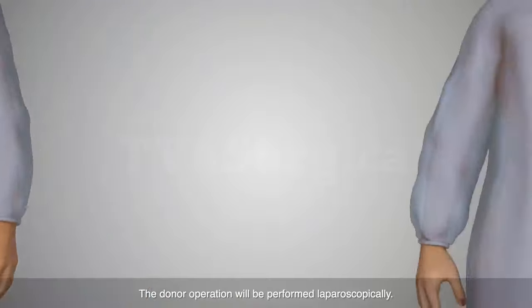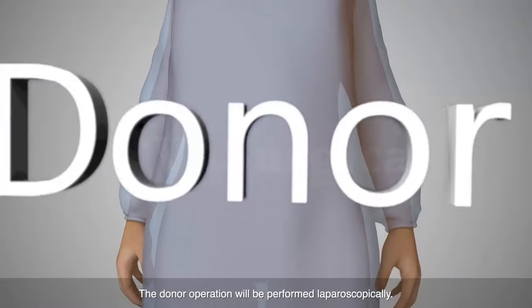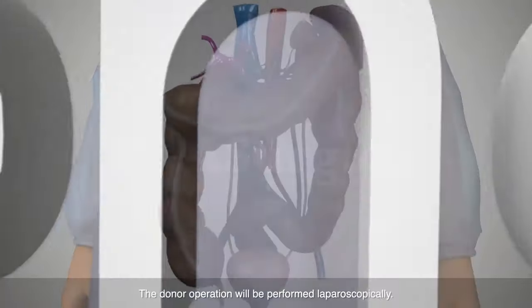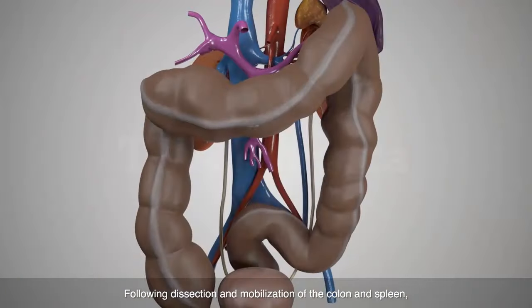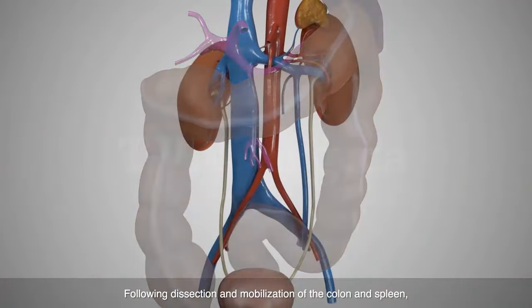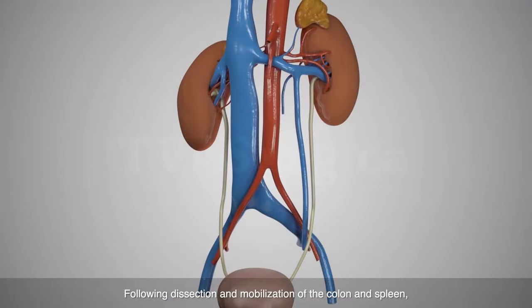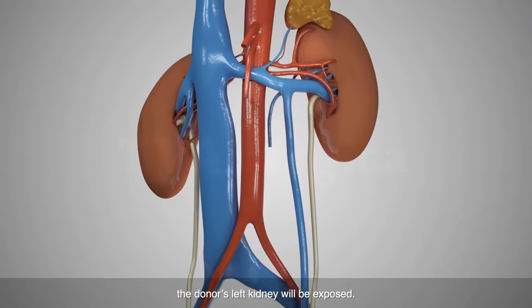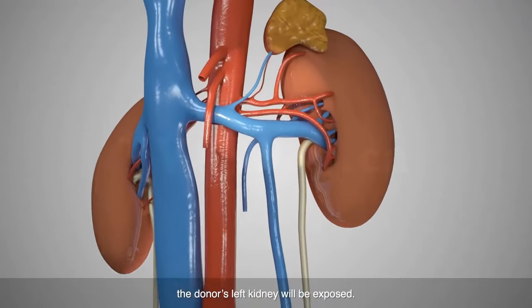The donor operation will be performed laparoscopically. Following dissection and mobilization of the colon and spleen, the donor's left kidney will be exposed.